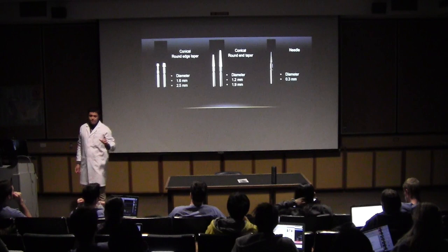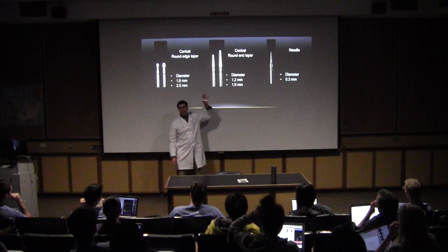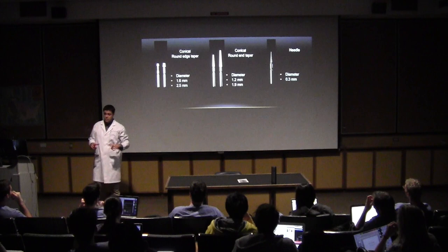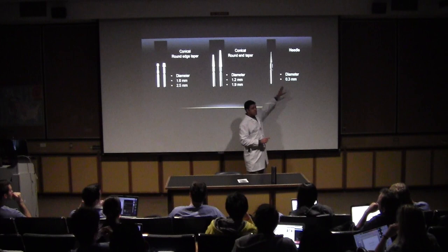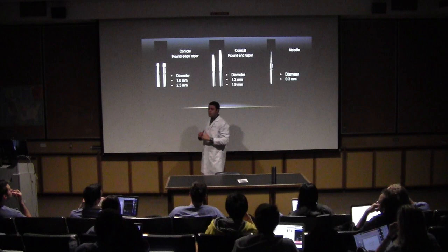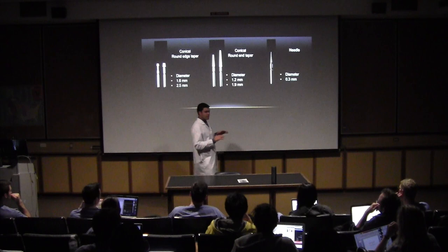The conical round end taper is longer, and the diameters are 1.2 and 1.9. This one is good to work on the gingival box, and the conical round end taper on the proximal box. And this one that looks like a needle has 0.3 millimeters at the active point. It's good for connecting the surfaces on the prep, so you can make smooth angles and a smooth, rounded surface along the prep. Okay.